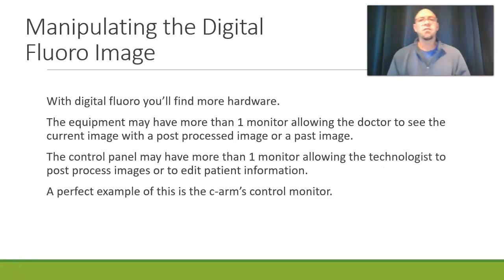Now, with regards to monitors, you may be thinking that when you use the C-arm, you have more than one monitor. But we don't have that when we're doing regular fluoroscopy in a regular fluoroscopy room. That's because usually in fluoroscopy, we're just doing a procedure where we just see the here and now. We watch the person swallow the barium, and we perceive what's happening, and the doctor's going to make some mental notes on what they want to discuss in their report. But it's not like we're injecting contrast and we want to play it back again and again, because we're not intervening with our fluoroscopy room in diagnostic radiology.